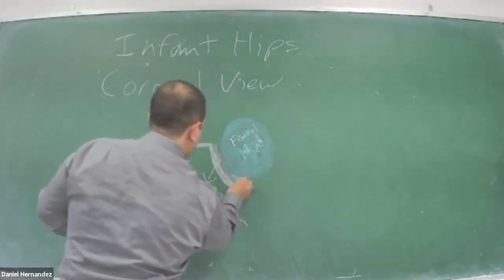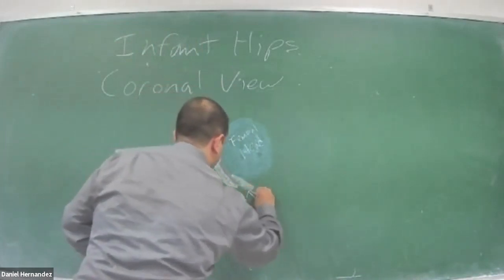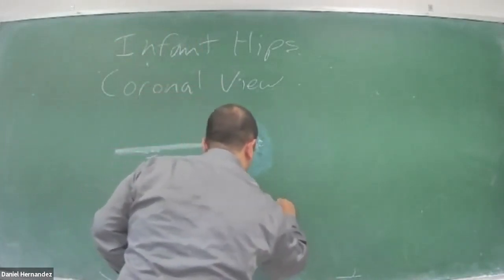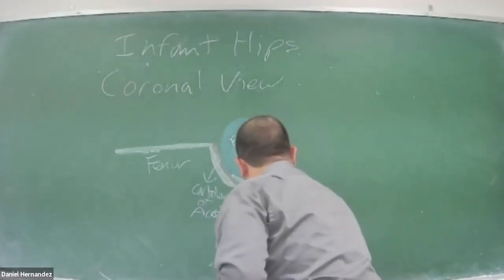Just posterior to that femoral head, we have that triradiate cartilage.